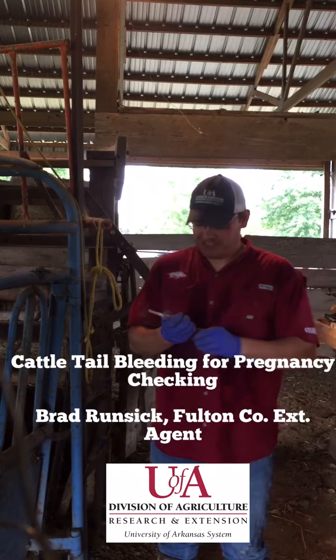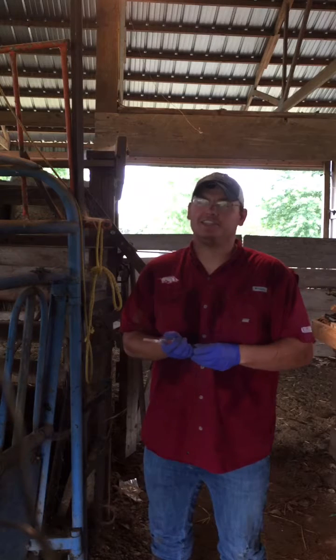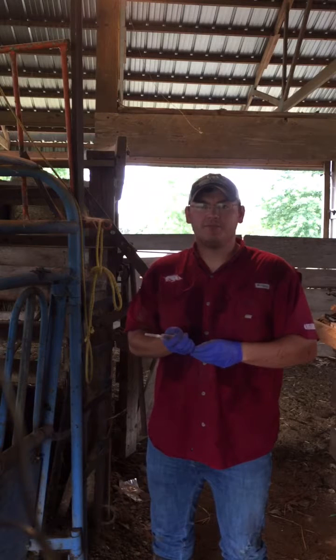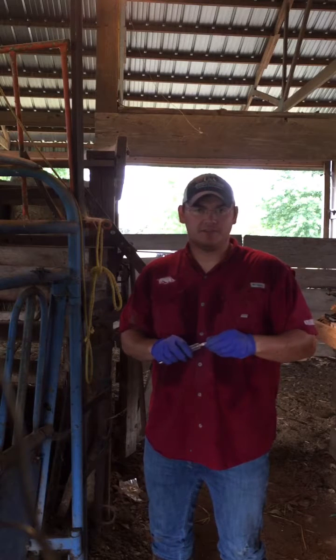This is Fulton County Extension Agent Brad Runzik and today we're going to demonstrate how to tail bleed cattle for the purpose of pregnancy checking. It is quicker, it's easier, it's cheaper, and you can do it much sooner after breeding than you can palpate them — as early as 28 days after being exposed to the bull.